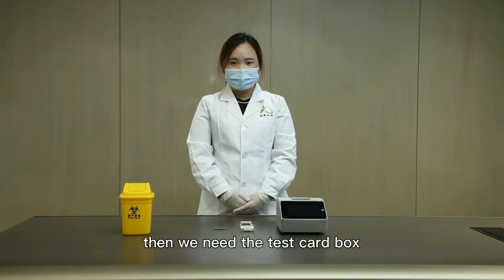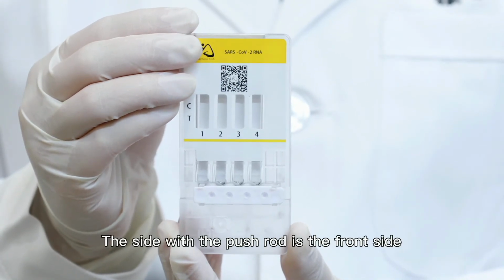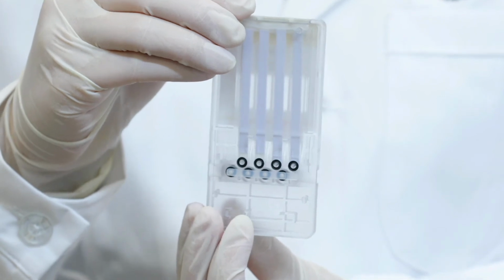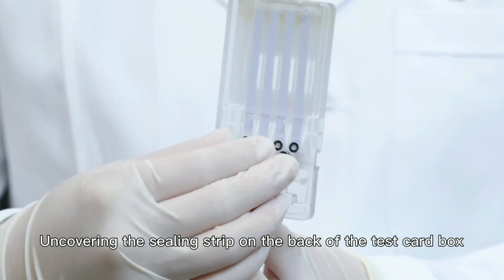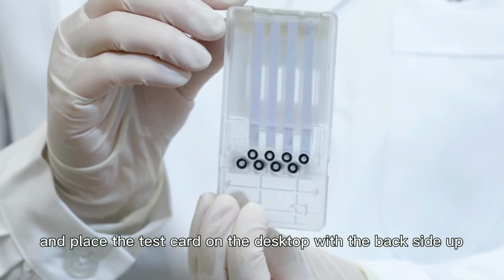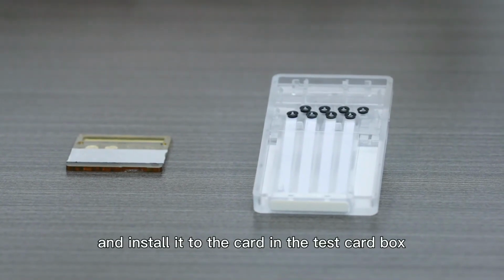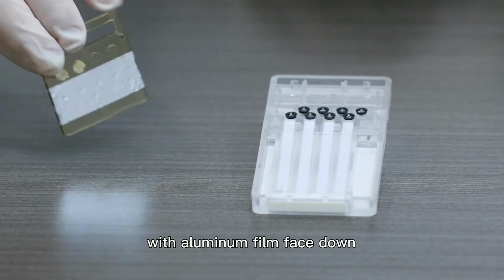Then we need the detection card box. This is the detection card box. The side with the push rod is the front side. The other side is the back side. Uncover the sealant strip on the back side of the detection card box and place it on the desktop with the back side facing up, taking the microfluidic chip from Xuanwu number 1 and installing it to the card slot of the detection card box with the aluminum film face down.